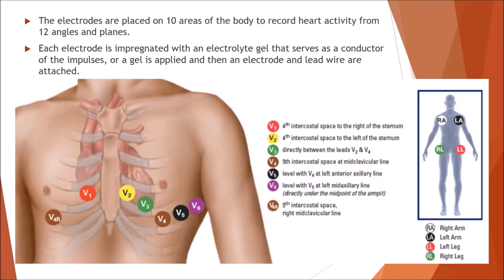All right, so this is really important. This is something you really, really need to know, and it's really only for testing purposes, because in the real world, you kind of place them as close as possible to this, and you don't actually have to regurgitate the exact verbiage that's used to describe the location of these leads, of these electrodes. But for the testing purposes, you're going to have to know them.